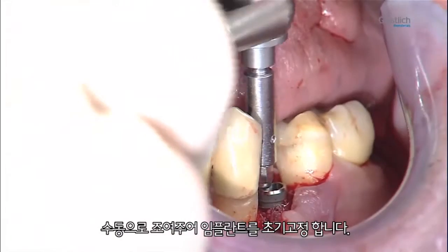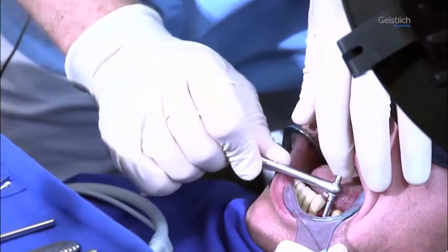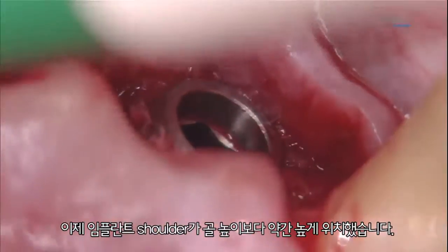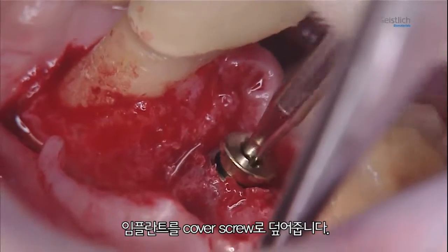Final primary stability of the implant is achieved manually using a ratchet. The implant shoulder is now located just above the bone level. The implant is sealed with a cover screw.